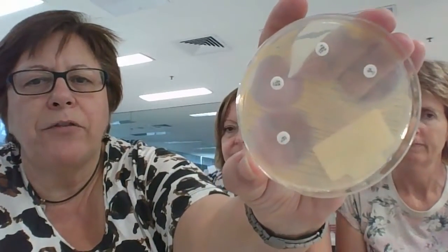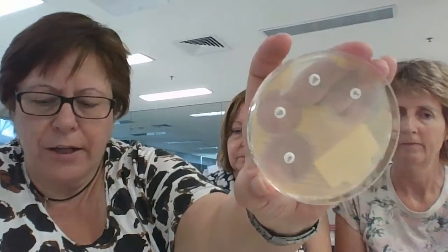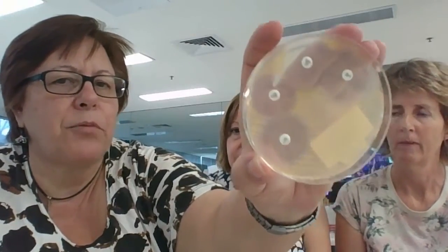So can you see here we've got paper discs with different antibiotics, and we can see that the organism is not growing near the antibiotics, so it's susceptible. We'll show you another one later where it makes such a difference, the reporting of susceptibility. Helen, you've done some blood cultures and CSF. Do you want to tell the students about probably the most important samples in the lab?